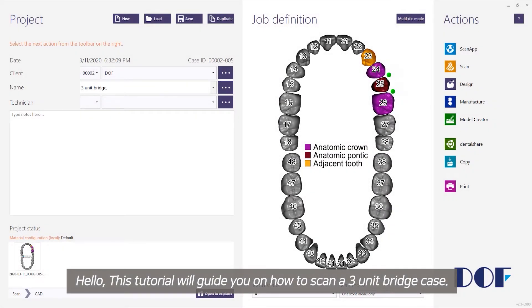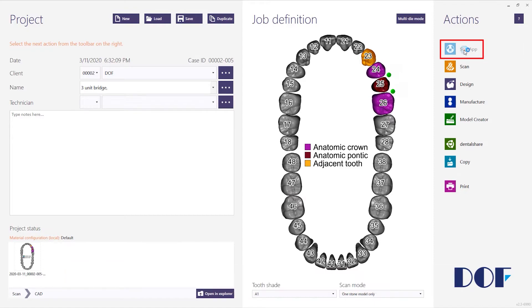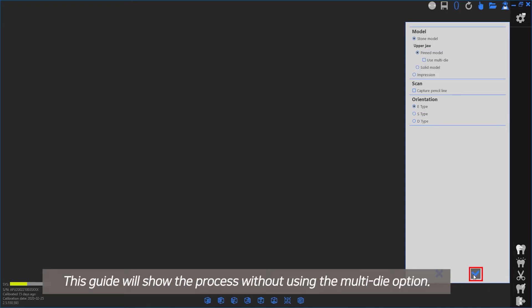Hello, this tutorial will guide you on how to scan a 3-unit bridge case. Begin by creating a project in ExoCAD and launch Scan App. If the model is Pindexed, select the option. You can use Multi-Die as well. This guide will show the process without using the Multi-Die option.